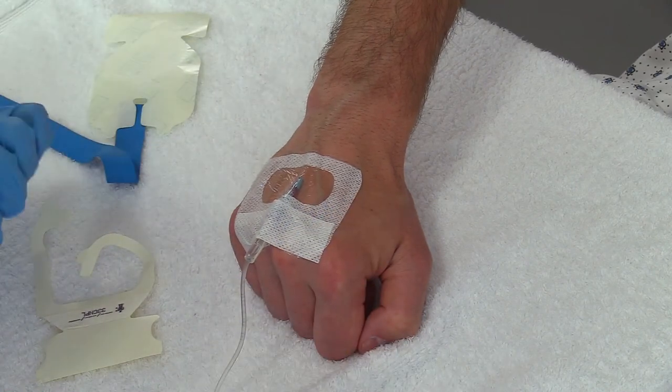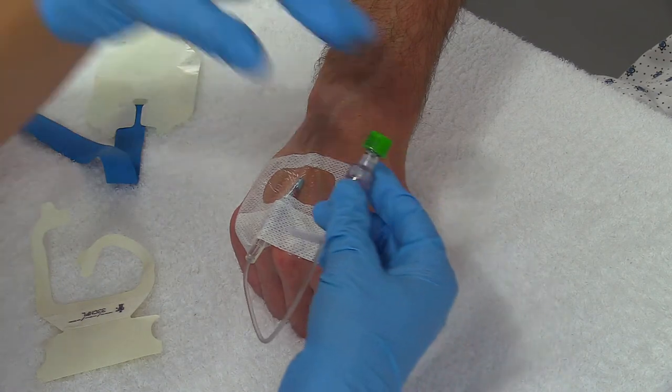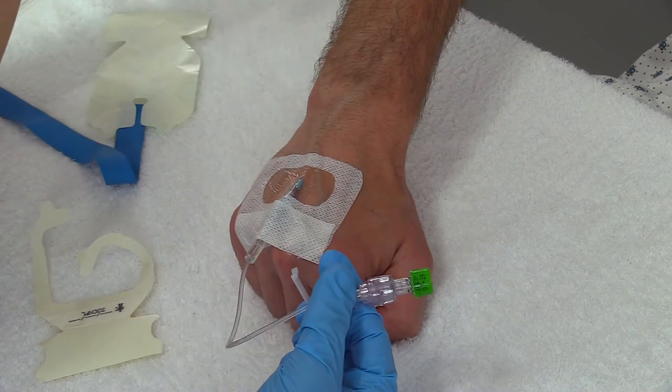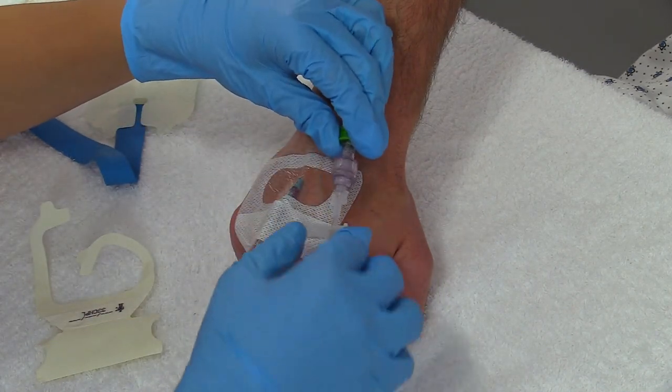With this particular extension tubing, remember the letter J, because that's how you want to secure it down. We don't want this flopping everywhere — that's going to put tension on the IV line, possibly causing the IV to slip out, and we want to protect it.